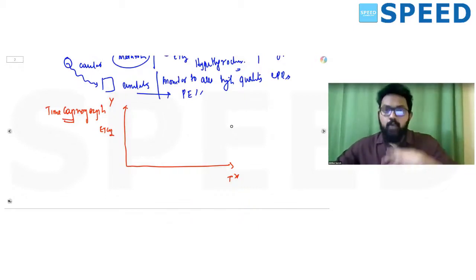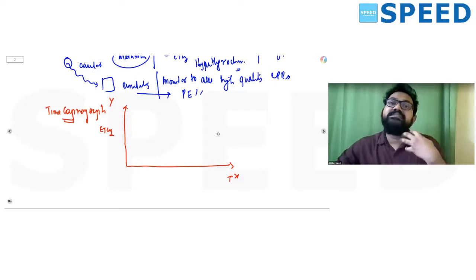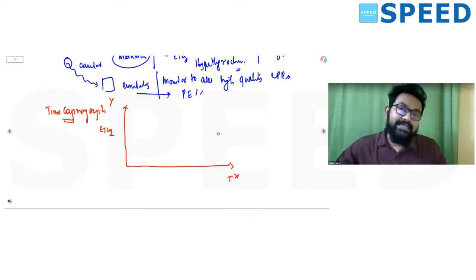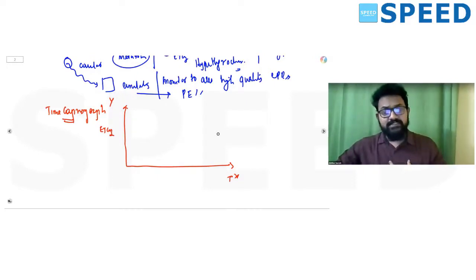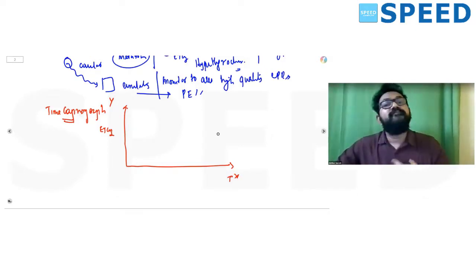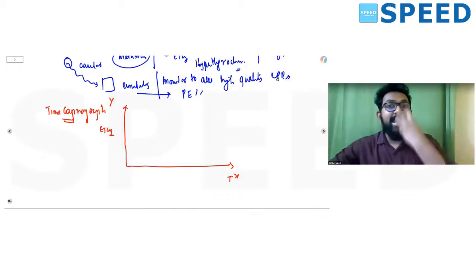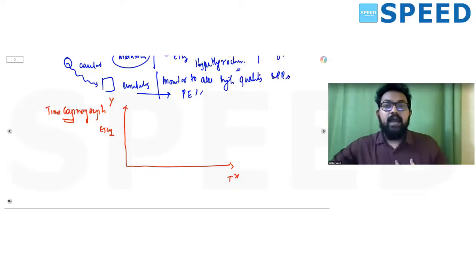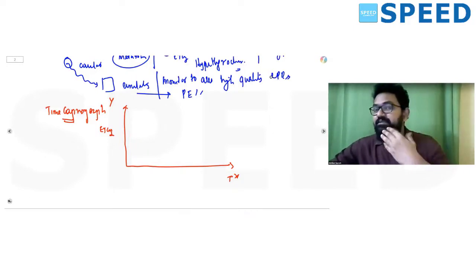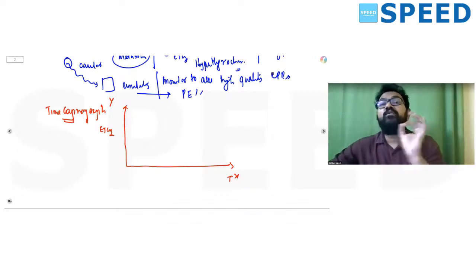Right? Now, how do you understand a capnograph? We are trying to understand the process of expiration, and the amount of carbon dioxide in expiration. What is the first thing that is going to happen? Imagine that you are expiring, breathing out. The first gas that is going to come out of you when you are expiring is obviously the anatomical dead space gas. Now, what do you mean by dead space?